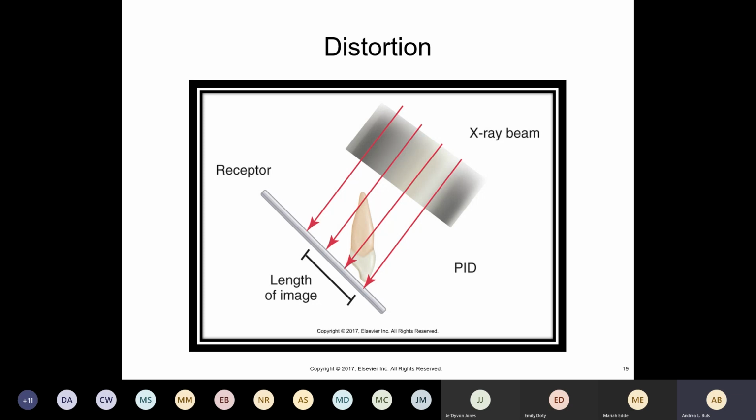If we could take that film and stand it upright and shoot perpendicular to the tooth and the film, now I've got an image of a tooth that's not distorted. But the root of that tooth is going to look all squatty on my film because of the angle that we see here. And there's more on page 79, where they show that whole distortion problem, what causes that, and what that looks like.